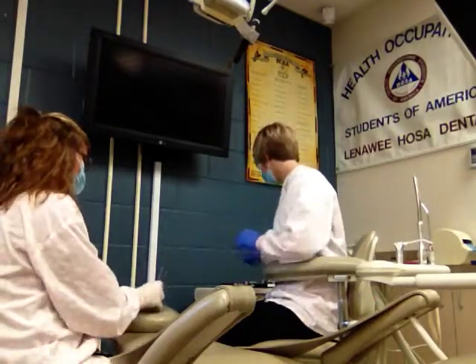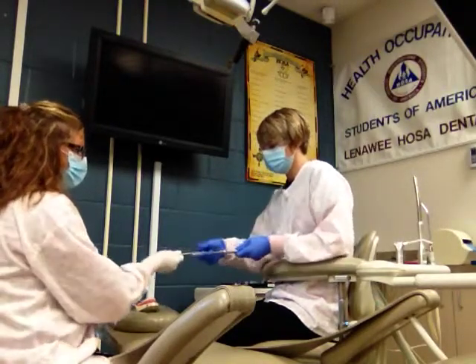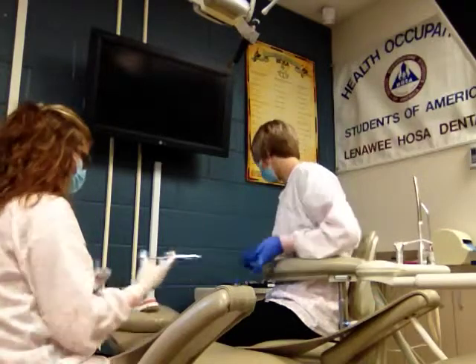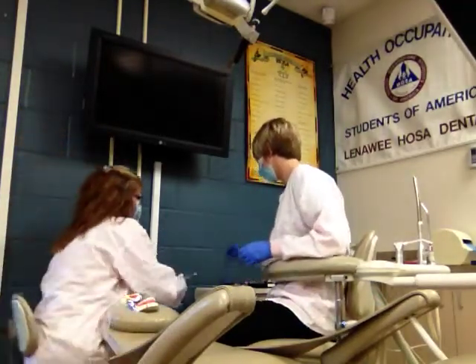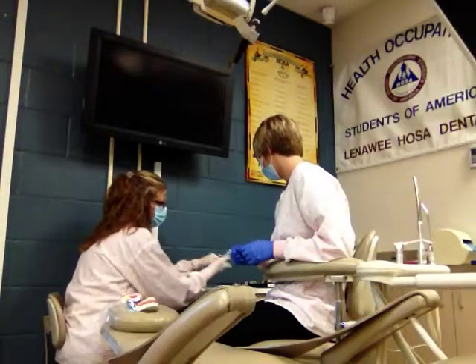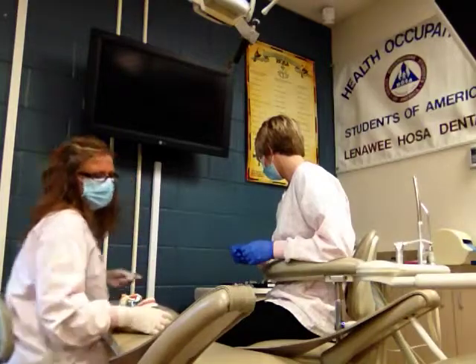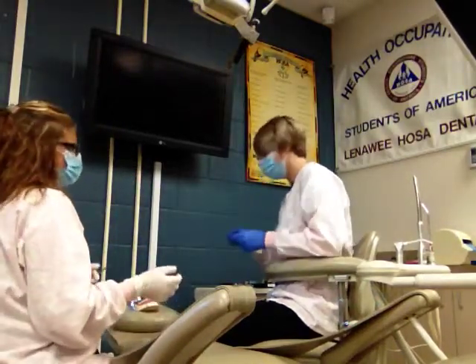We're going to do anesthetic. Keep in mind for this, they might actually have IV sedation. And we would use more than one cartridge of the anesthetic, so we would have to replenish that probably twice. We want them good and numb. We'll let the patient sit 10, 15, 20 minutes. When they come back, we'll make sure that they're numb.